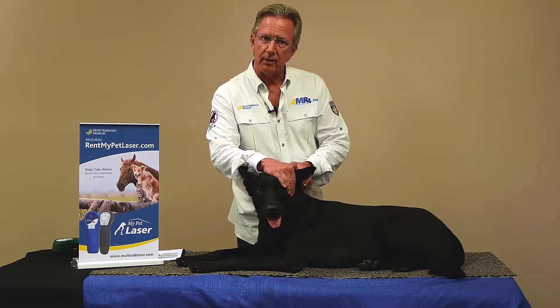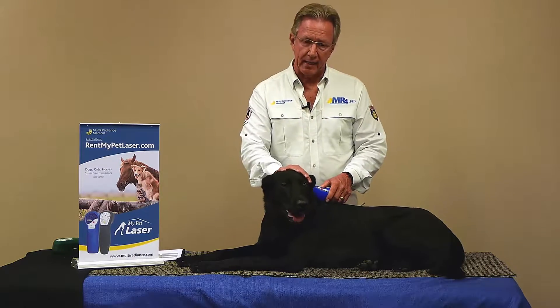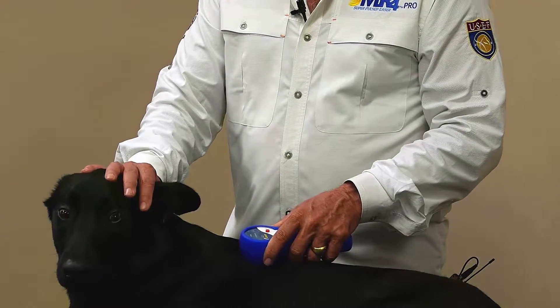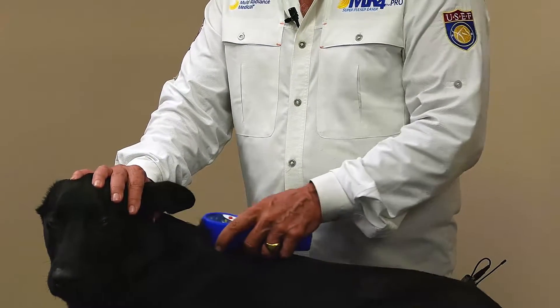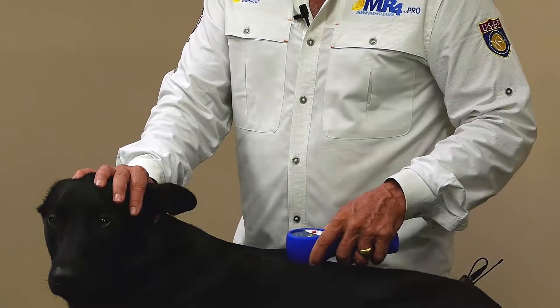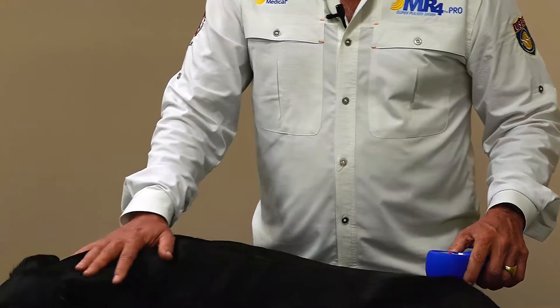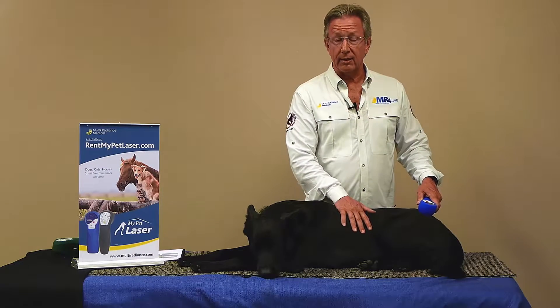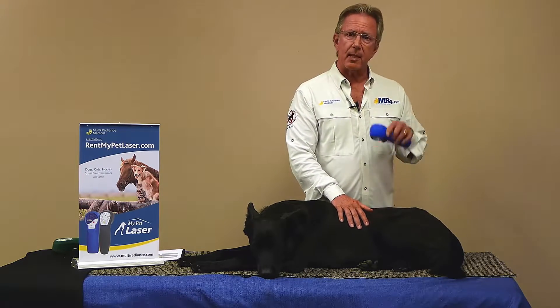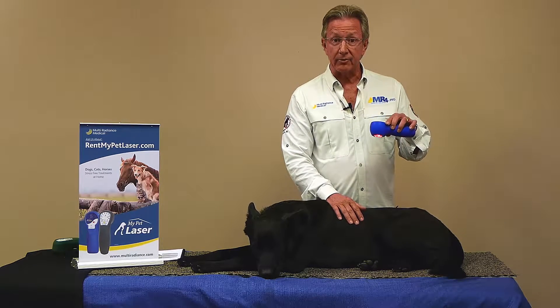You just start up at the base of the skull and at about a centimeter per second, your vet will have you slowly scan right along the spine — not over the bone itself, but off to the side. We call it distal to the midline, so you're hitting all those nice nerve roots. For any of you that have had acupuncture, you know that these nerve roots are absolutely part of what the acupuncture process is all about. We've just changed it up with high technology to call it laser puncture, because we can get the same effect with lasers as we might with needles, but with no needles being stuck in.